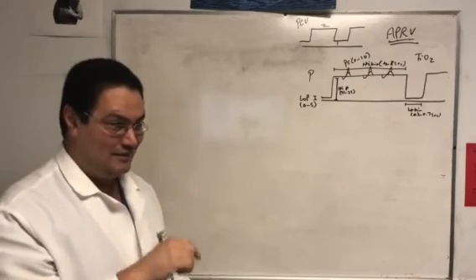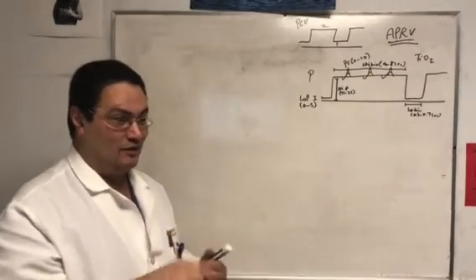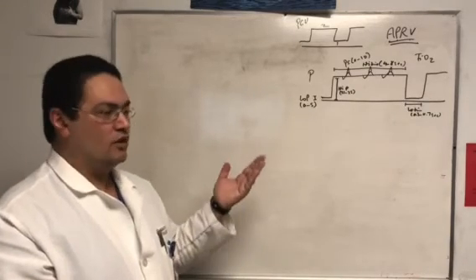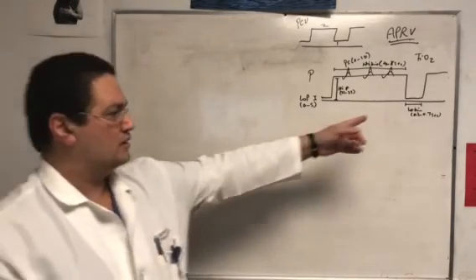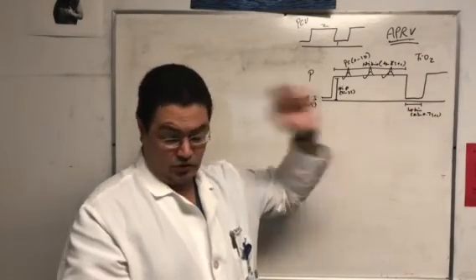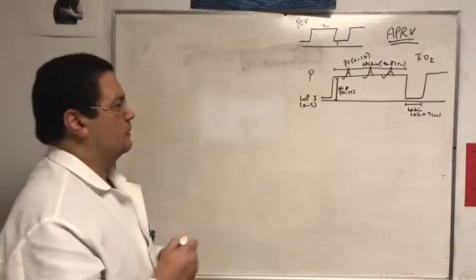The reason I'm saying that is that when you move to another hospital, it doesn't have the asterisks. You know the asterisks? That you have to fill this cell, or another hospital where you write the settings with your own hand. You don't want to miss settings like this, because one setting, for example, can kill the patient if somebody does it incorrectly. And I'll show you how that can happen.